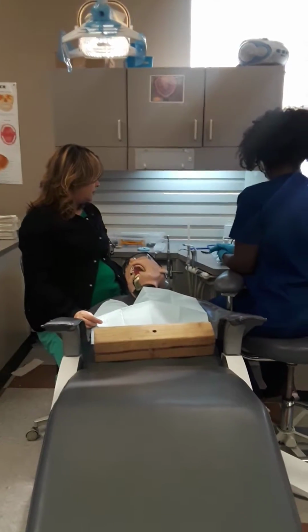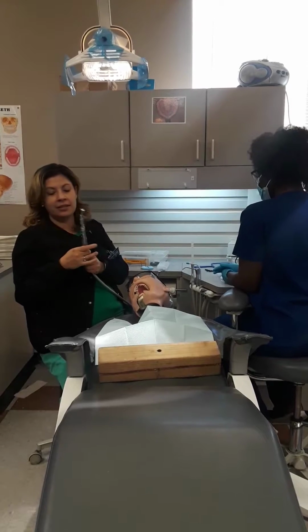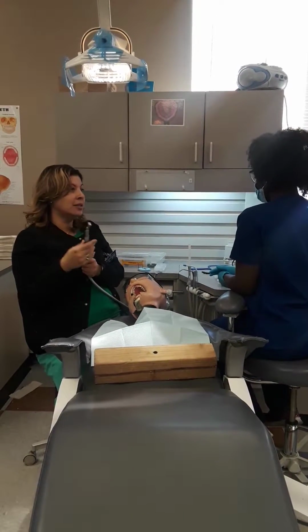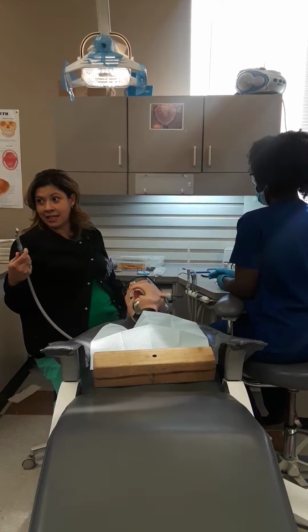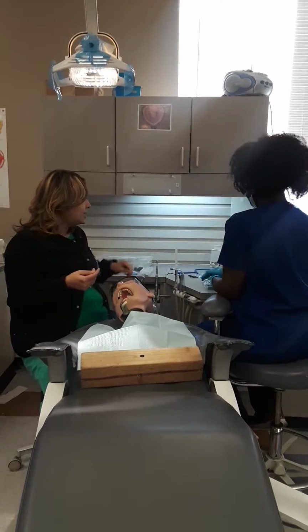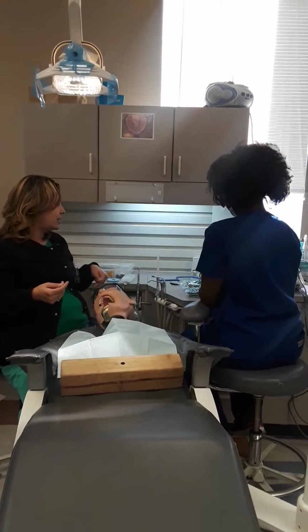Next. Slow speed handpiece with 2 or 4 round burs. Okay, your slow speed is a 3 unit. You have a motor, you have a straight, and you have the contra angle. Okay, so you need those. This actually removes decay at a slower speed than the high speed. Basic setup. Basic is in our setup. Anesthetic setup. Anesthetic is present.